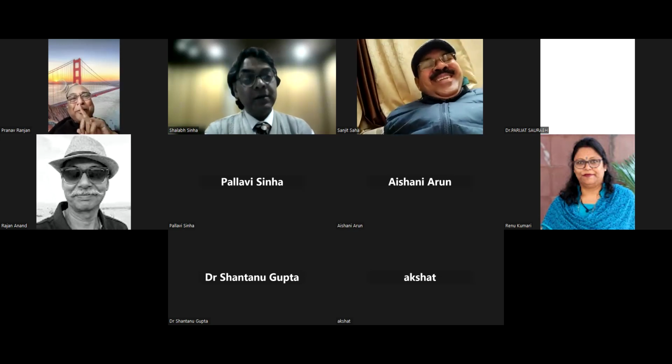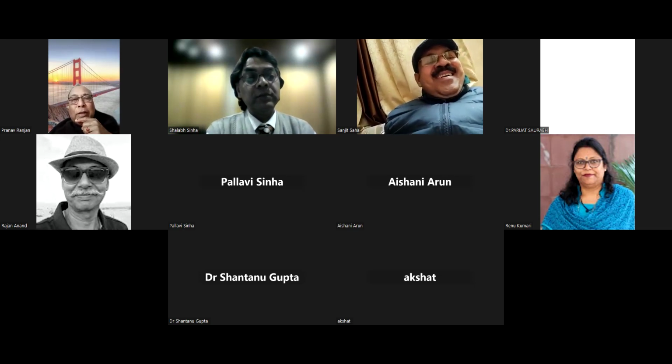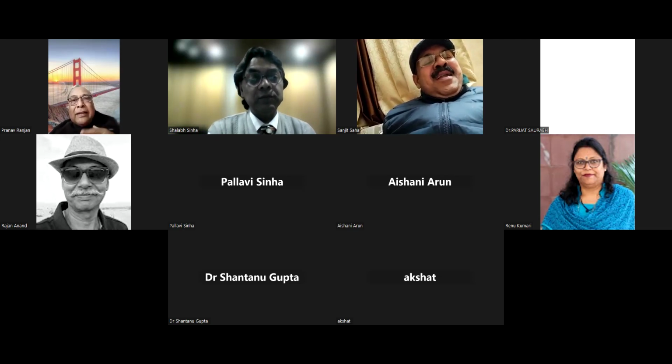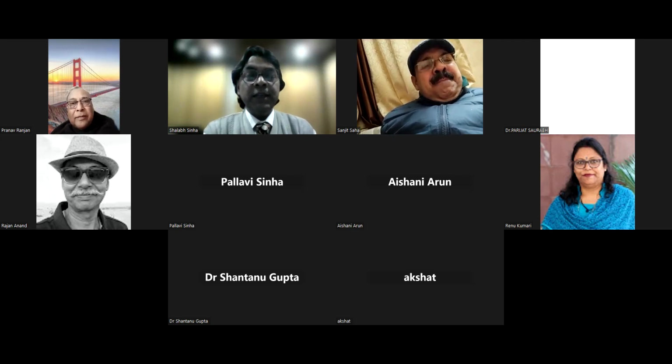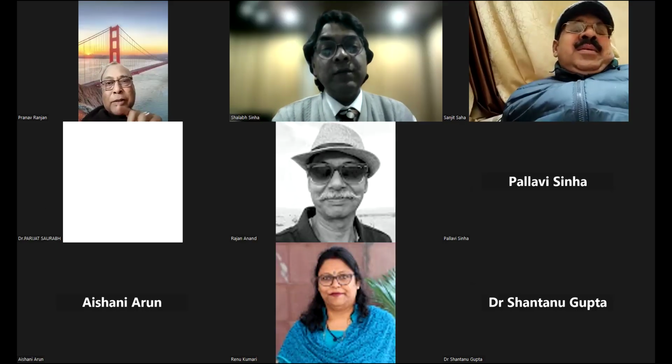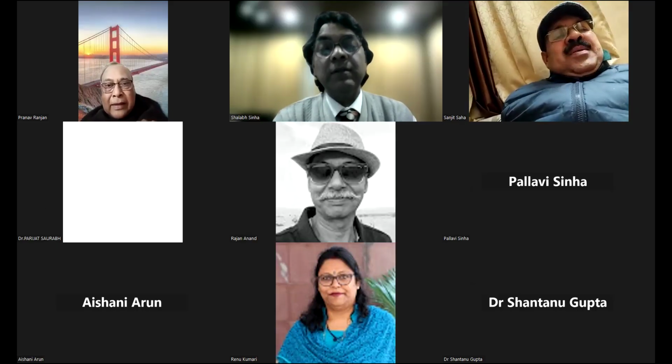And second, one more thing, Shalabh, what I observe while loading the lens, when you are putting the lens in the cartridge, what I do personally is that I always place the leading haptic on top of the optic and then push it in the cartridge and then close the cartridge. That was the advantage. Because what I saw, you just place the lens and close.